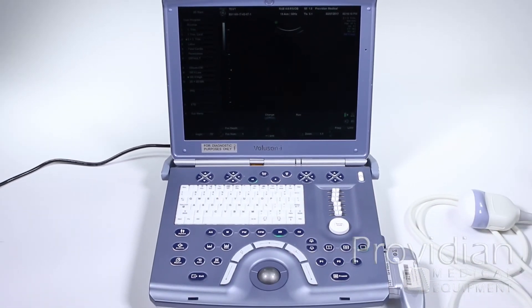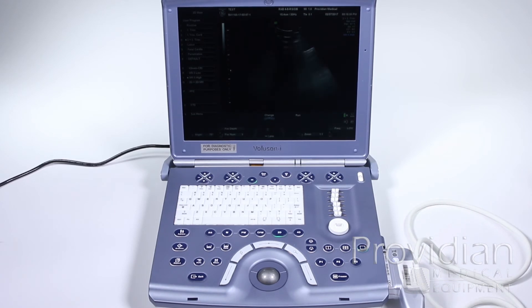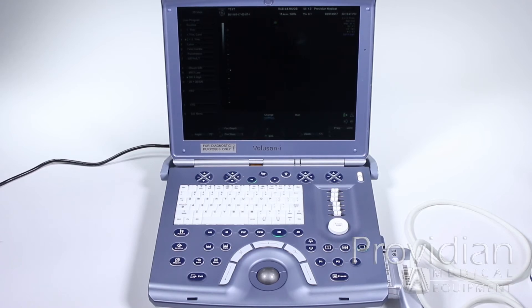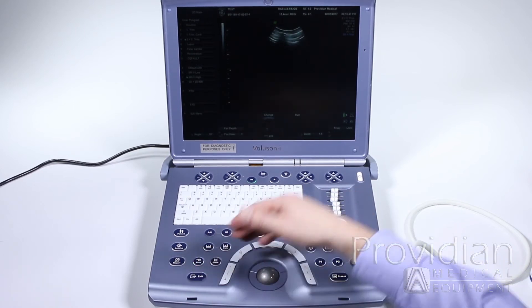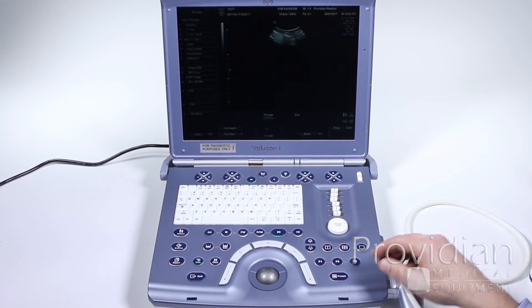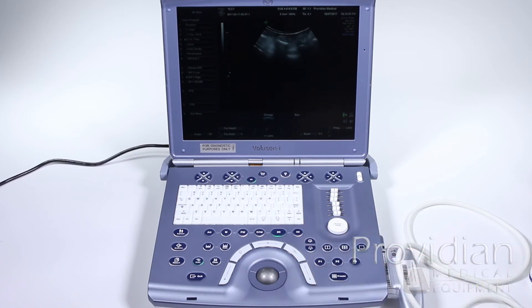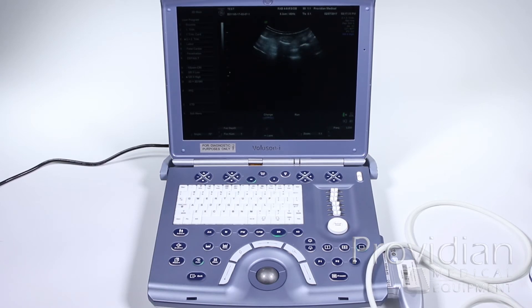In the previous video we did discuss a lot of these buttons and what they do. I won't go into them again, but we will be using the various features — so if you don't know where to find some of these keys, go ahead and watch that first video. When we begin scanning and choose that probe, it goes to a live imaging screen. On that live imaging screen we can adjust our gain. We also have the auto optimization key, which will look at the image and try to adjust the TGC and gain to best give you the best image. I'm just scanning my hand here, which is why you're not seeing anything. We can also adjust our depth.